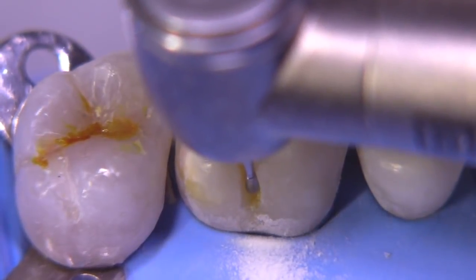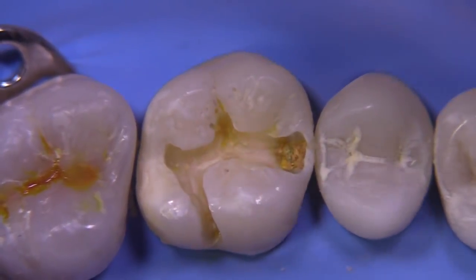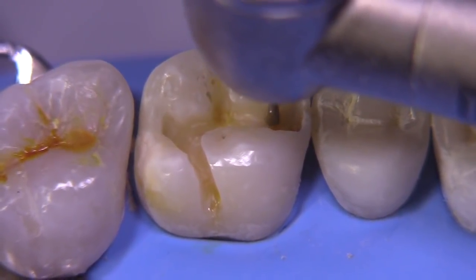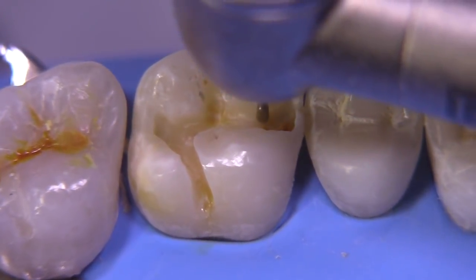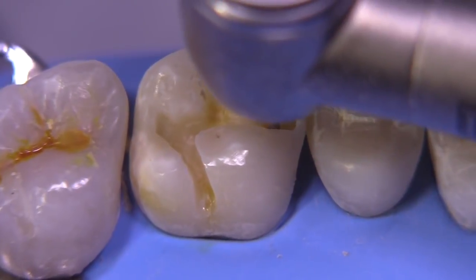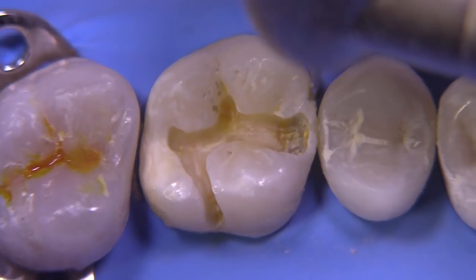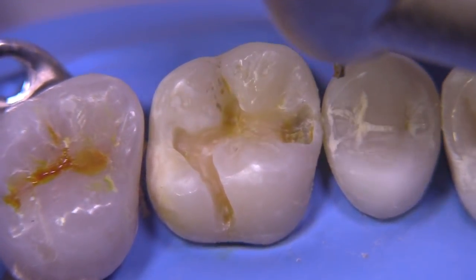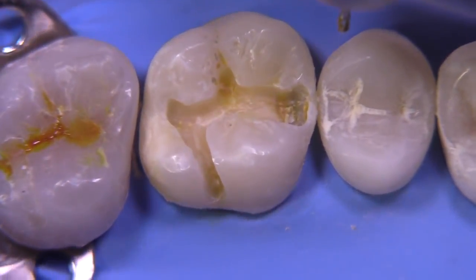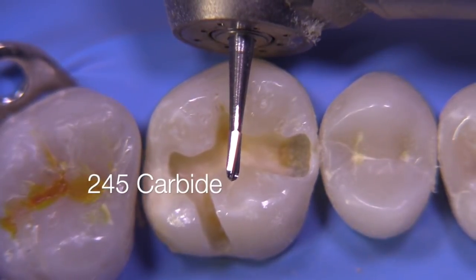We don't really want to worry about the caries on the pulpal axial wall. We want to focus our attention on the caries on the peripheral areas, which is really hard to do because once you encounter caries, we kind of get excited — this is something I can remove. But you have to have some discipline to keep yourself from moving into those deep spots. Remember, step one of GV Black's preparations is to obtain your outline form, and the outline form should be caries free.